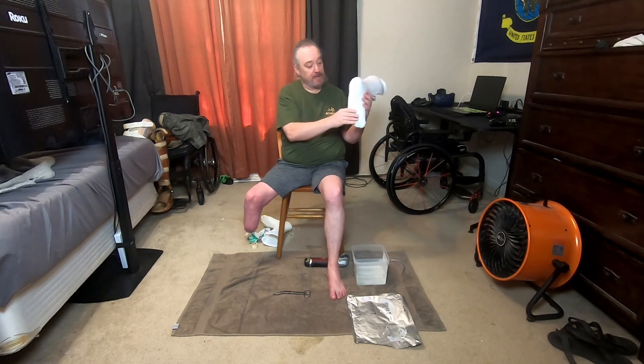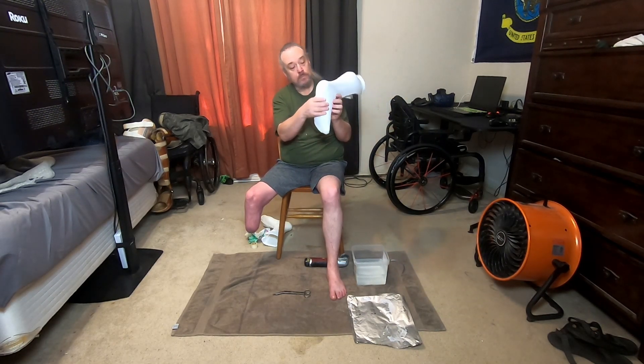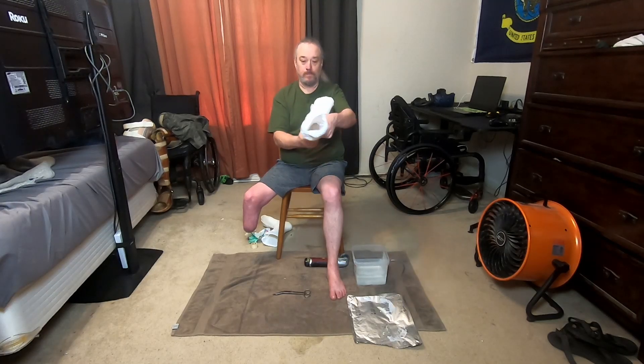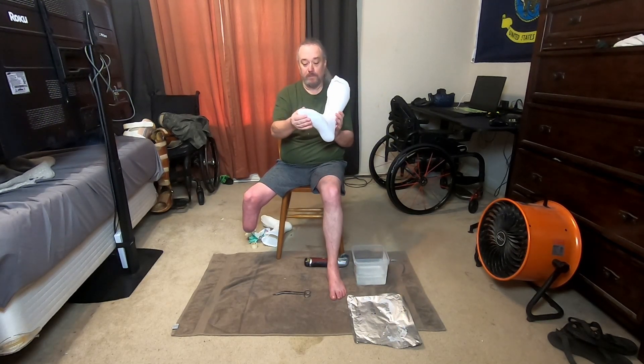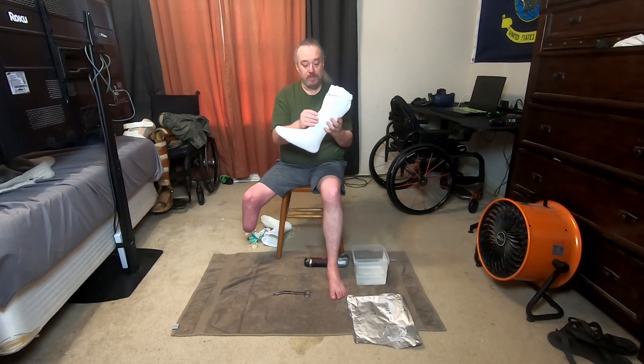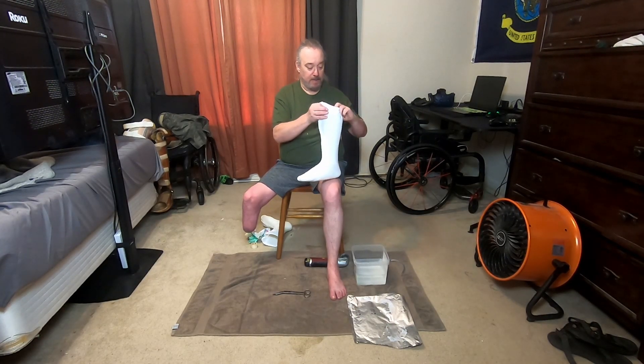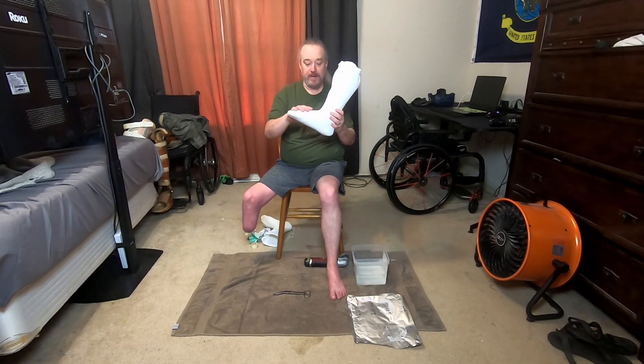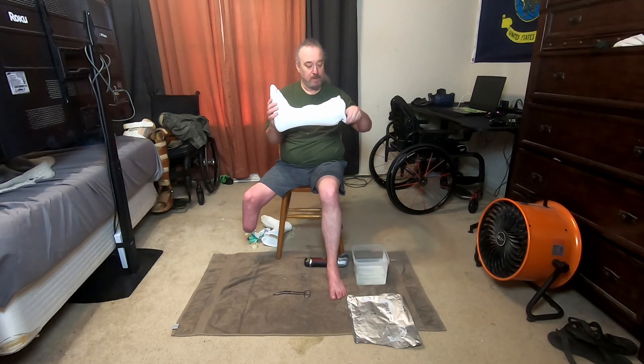I've got the arch molded nicely. Let's see down inside — toes are nice and formed. What you'll do is you'll seal this part up and take out this thing. Once this is all out, you'll fill it with plaster. So this is your negative mold, and then you'll have a positive mold to use.